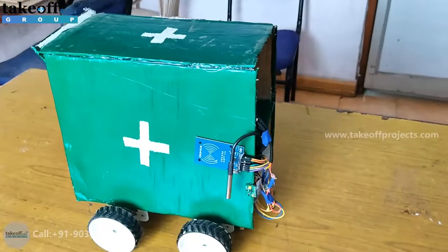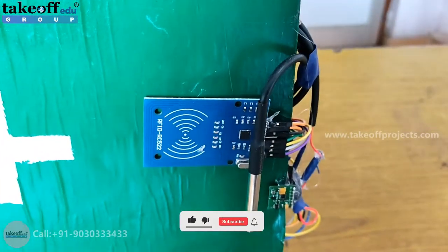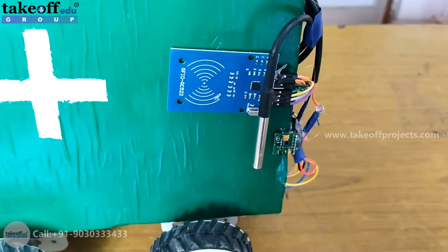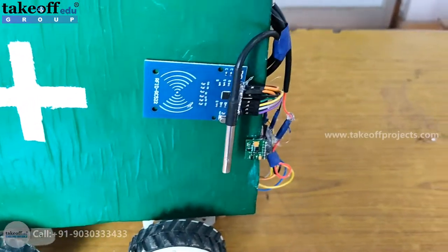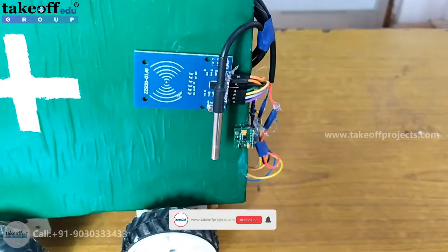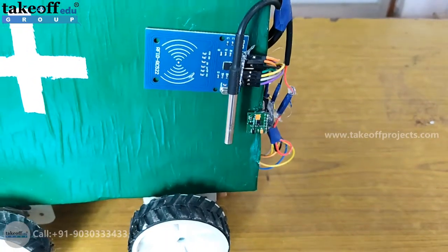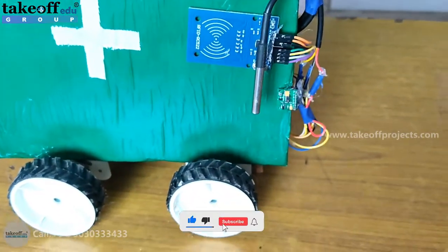Let's see the components used here. There is an RFID reader module on this robot. When the robot goes near the patient, the patient has to swipe the card so it will read health parameters like body temperature, heartbeat, and oxygen levels.